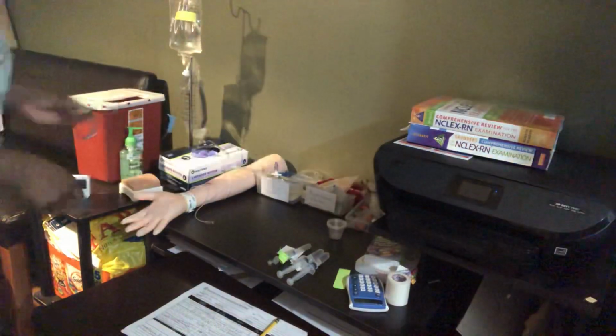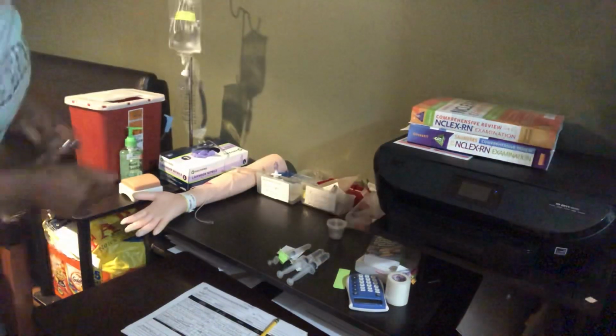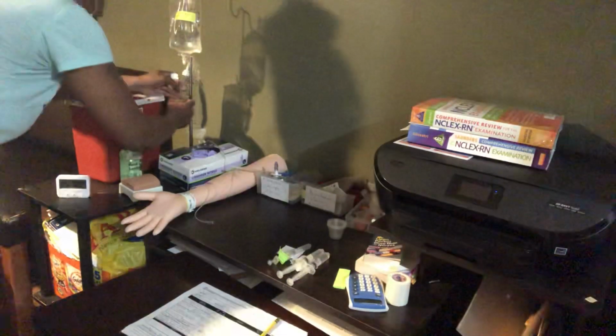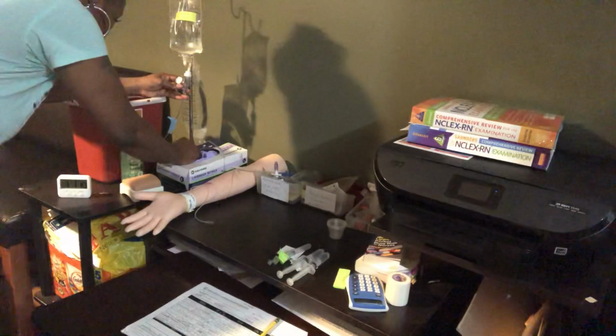Okay, I'm ready for you to check my drops. I got enough time to check it for 1 minute. So let's go for the full minute and see what we got.